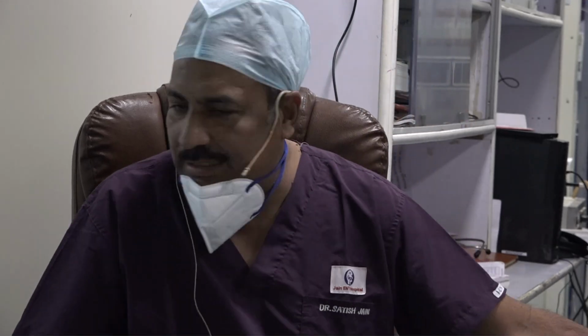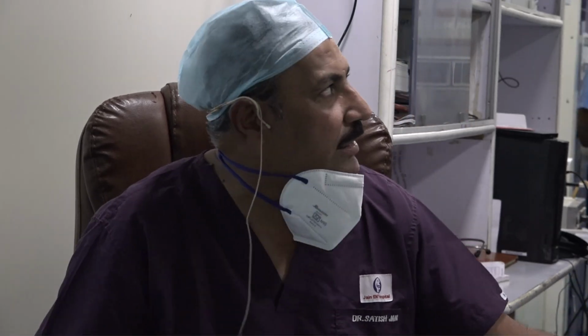So in today's session we have 3 hours. It's already 4:15 or so. So we'll be starting with the basics with the tympanoplasty, and then after that we'll be doing one cochlear implant.